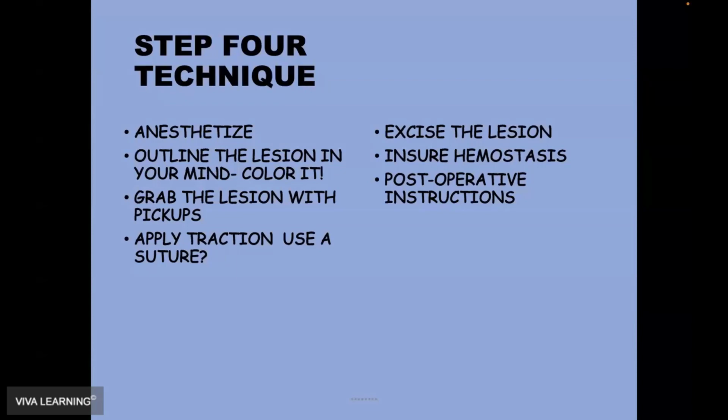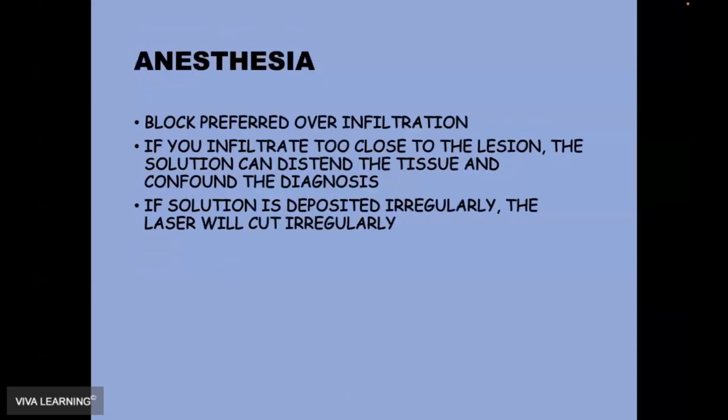Anesthetize. Outline the lesion in your mind and color it with a marking stick. Grab the lesion with pickups, or what I like to do is put a suture through it rather than holding it with pickups. Excise the lesion, ensure hemostasis, and give post-op instructions.